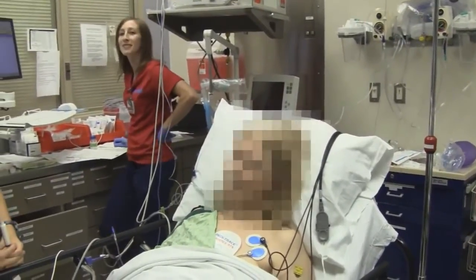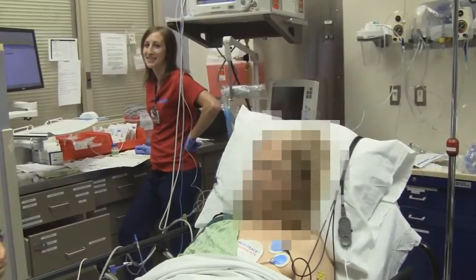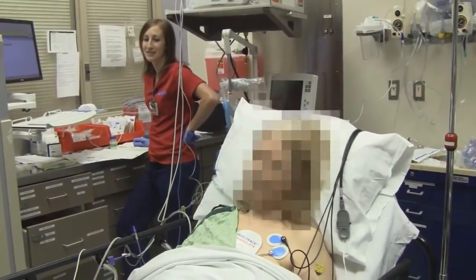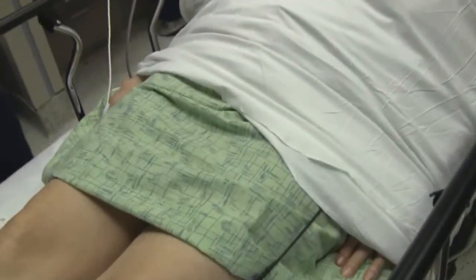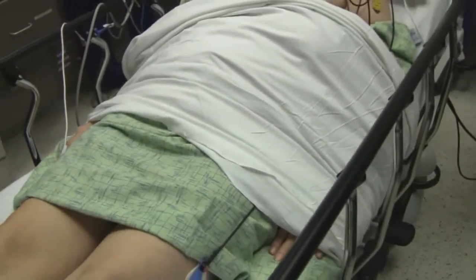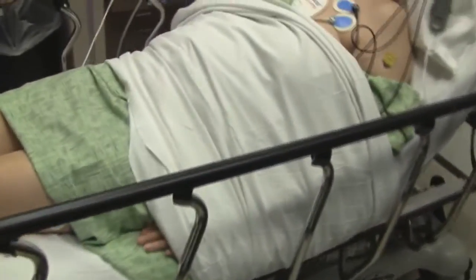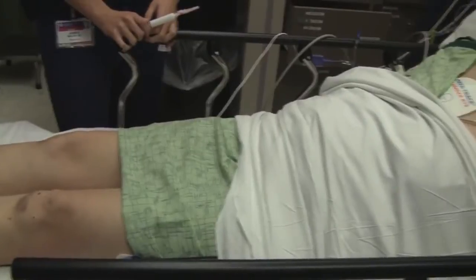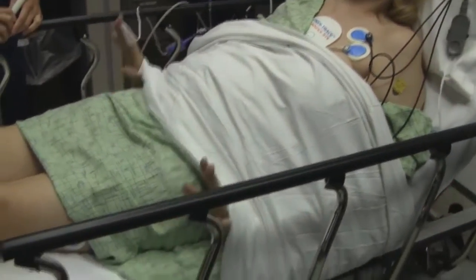Do you have any words of wisdom? One learning point is we like to tuck in patients' arms gently, so that when they're cardioverted, their arms don't bump up and it minimizes the risk of hand or finger injury on the side rails. Good point — tuck you in snugly, not too snug.